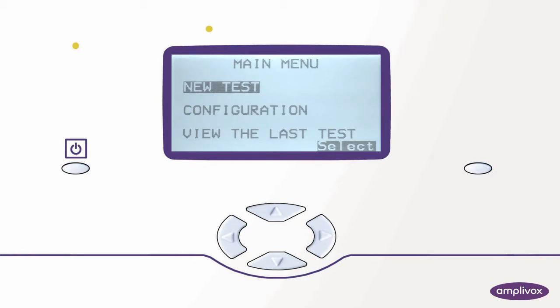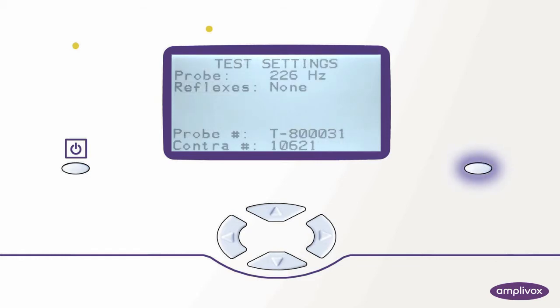First we need to review our current profile settings which is easily done by pressing either the button on the probe or the display mode button on the 302 unit. We can now see that our current tympanometry probe tone is set to 226 Hertz and no reflexes are activated.